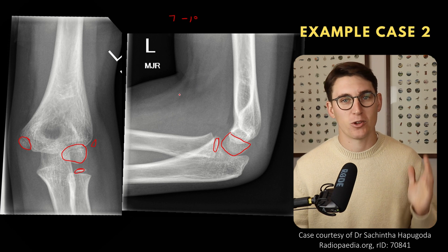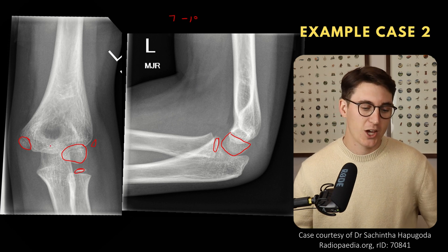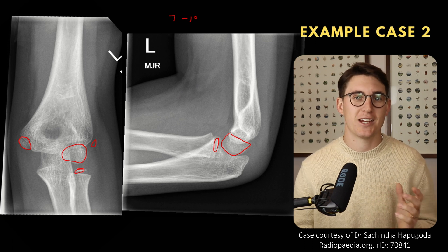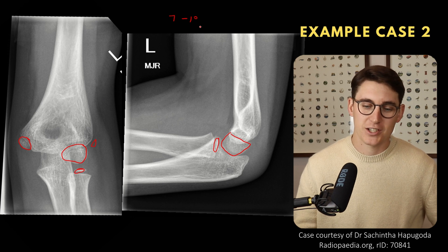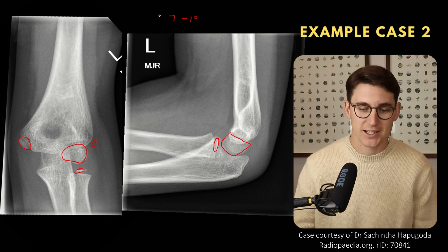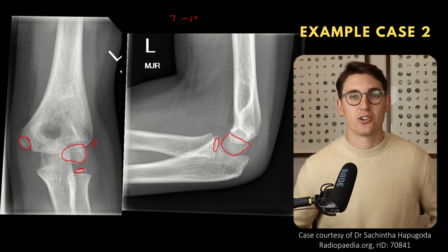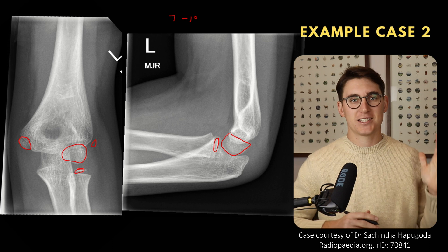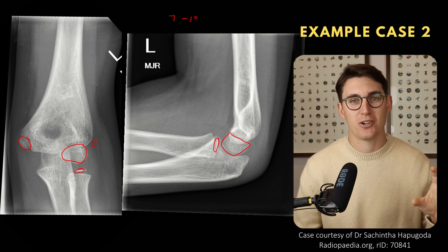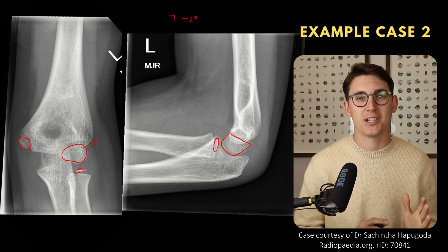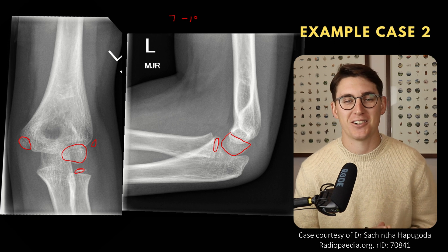If we were to use the other system — the odd numbers 1, 3, 5, 7 — we would estimate that this patient is between ages five and seven. You can see how there's a lot of variation. For an exam, learn the slightly more complicated system to get more accurate. This patient, in fact, was 8 years old — so it's not that difficult. To summarize: go through step-by-step, C-R-I-T-O-E, and make sure that your internal or medial epicondyle appears before your trochlea, olecranon, and external or lateral epicondyle.